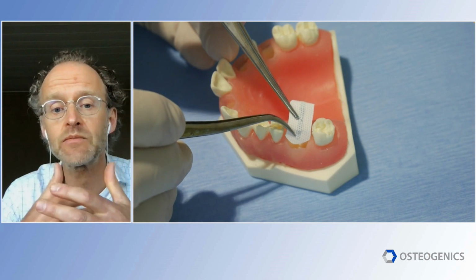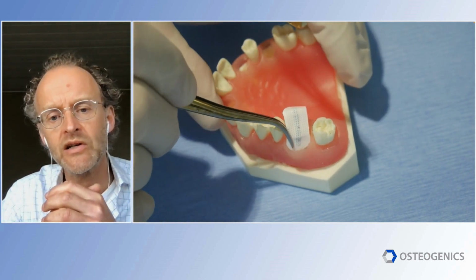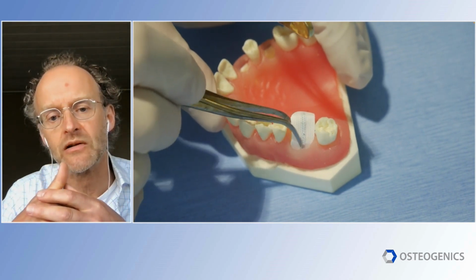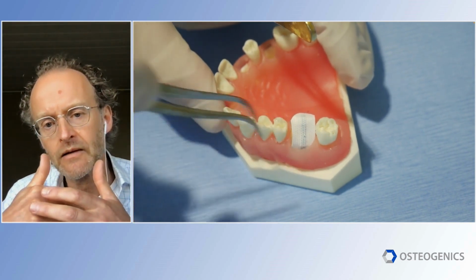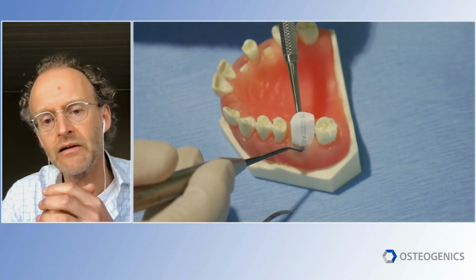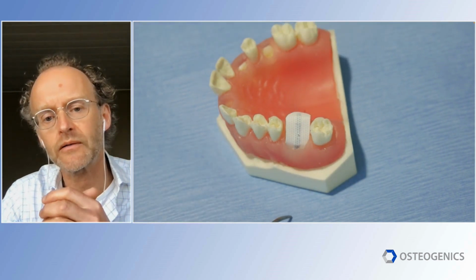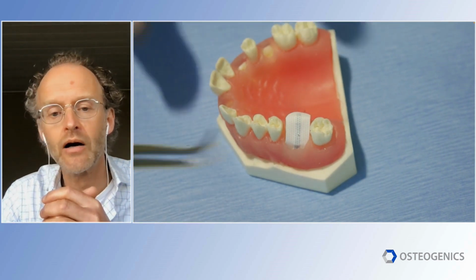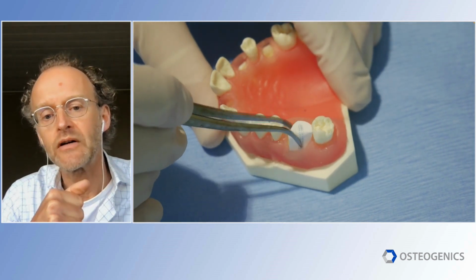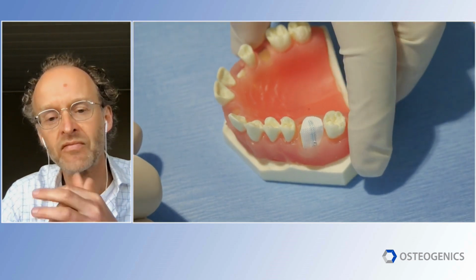There's various techniques, but I'll just show you a couple. Then you take your surgical tweezers and you place it in the envelope which you made with the tunneling procedure. You place it in, and then you're gonna check if the membrane is really past the border, the bony border. And if you're sure you are, you can take the tweezer again and place it really deep, so you have stability of this membrane before you place the bone graft.